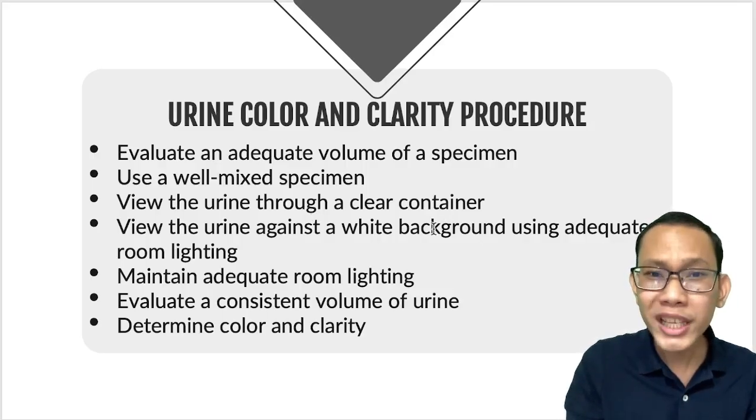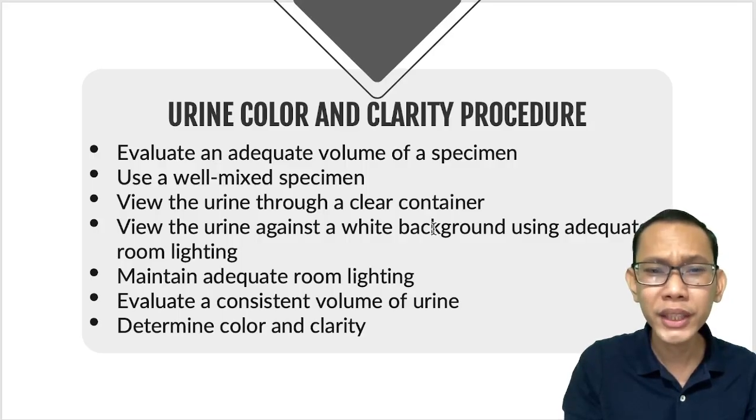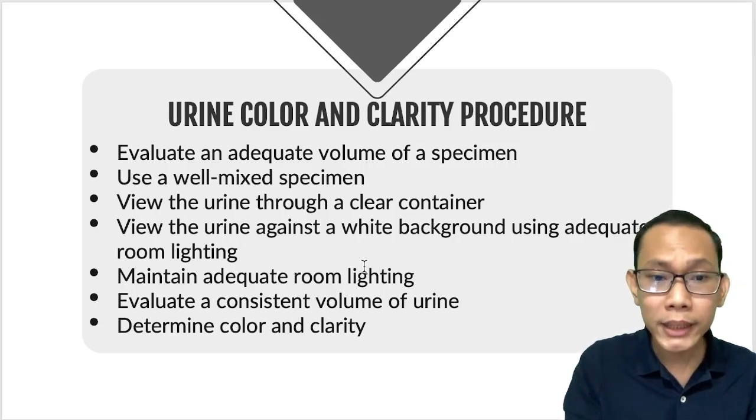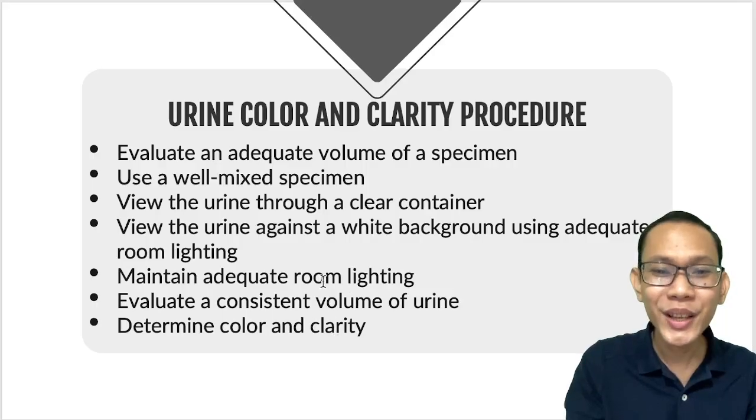But again, through experience, as long as you're already confident, it's a lot easier for you to identify, then there's no problem with that. Maintain adequate room lighting, evaluate a consistent volume of urine, and finally, you determine now the color and the clarity. So, ito na yung ating physical examination. Color and your clarity.